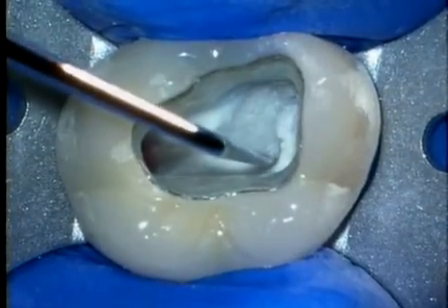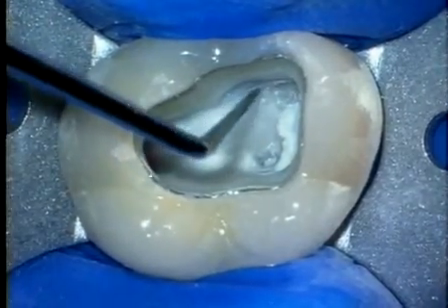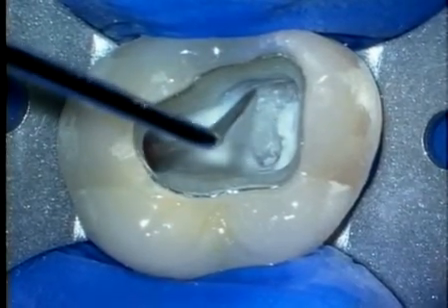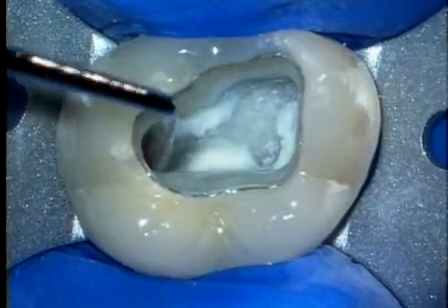The explorer is pointing to the DB, the MB, and the related groove, which commonly holds the MB2. And of course, we also have a palatal orifice.